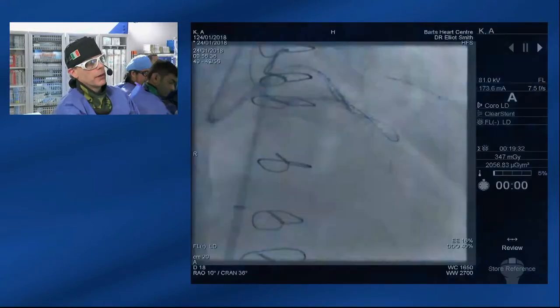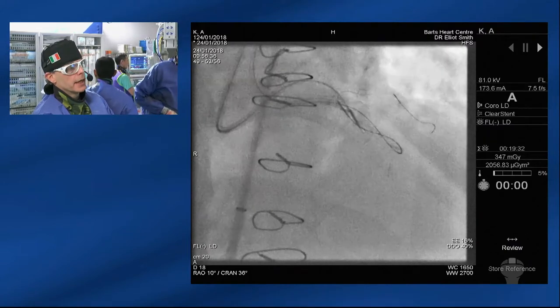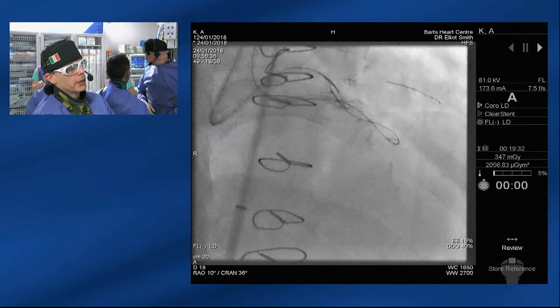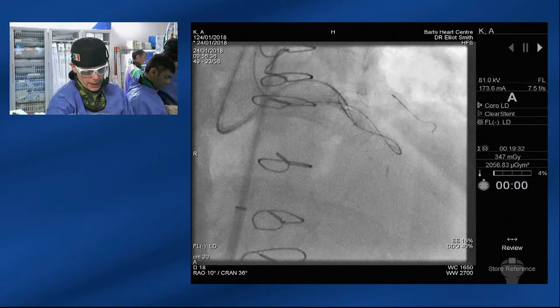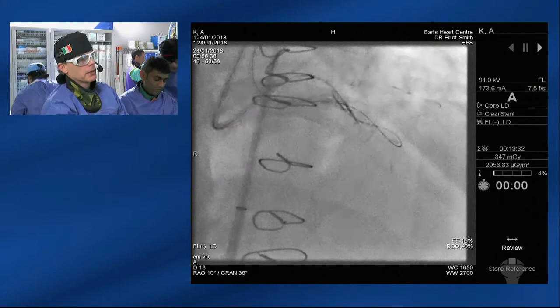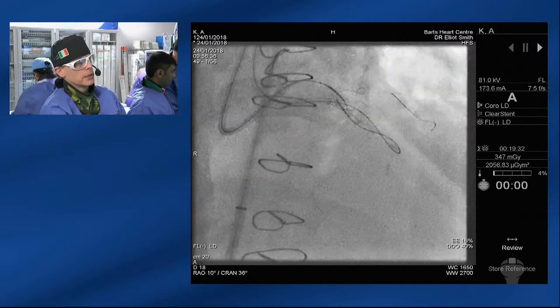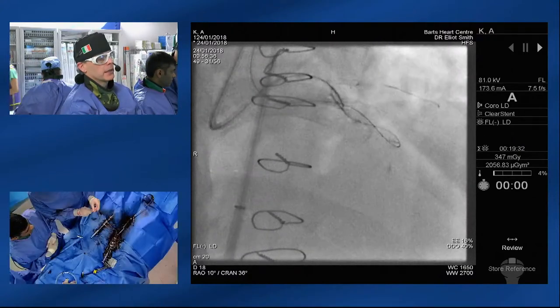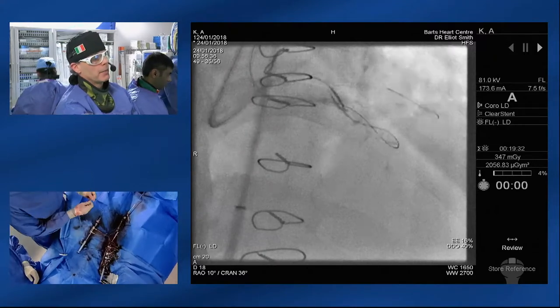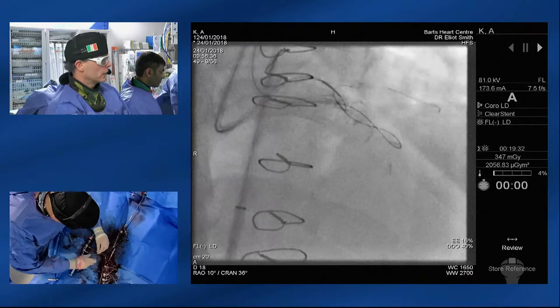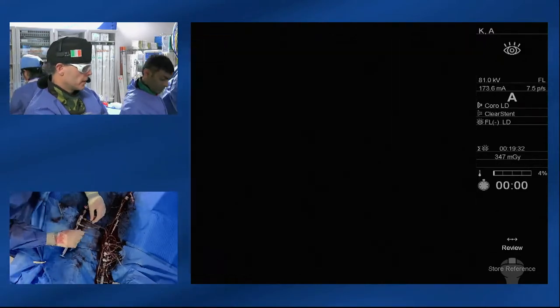Elliot's taking the Confianza Pro out. He's put a Fielder XT down and pushed it very gently — it looks like it's conformed to the vessel very well. When advancing retrograde equipment into the left main, we must be absolutely certain we're not in the sub-intimal space. The only fail-safe way to do that is with guideliner reverse CART: bring down a guideliner over the antegrade wire, balloon the proximal cap, and deliver the guideliner into the occlusion segment. Then wire the occlusion segment with the retrograde wire. That way we can be sure we're not going to compress the proximal left main, which can be hemodynamically catastrophic.